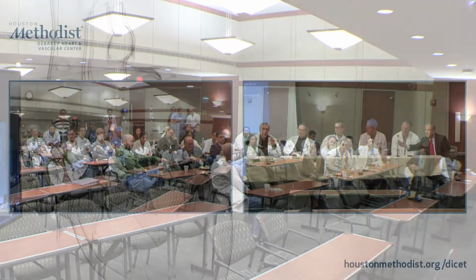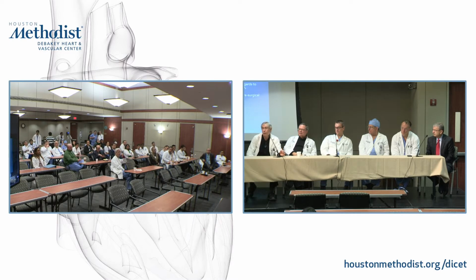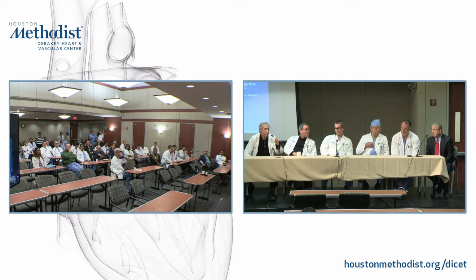But again, with CT, we've looked at many mechanical valves, a lot of times in patients who are going for coronary disease evaluation and have mechanical valves, where we just happen to gate them and look at the valve's function. Just as in the aortic position, you can very nicely characterize the mitral valve as well as the aortic valve with CT.